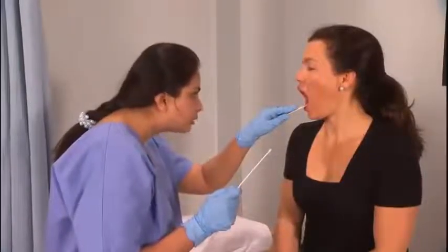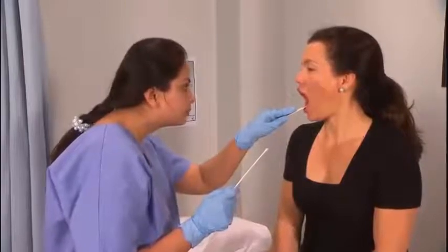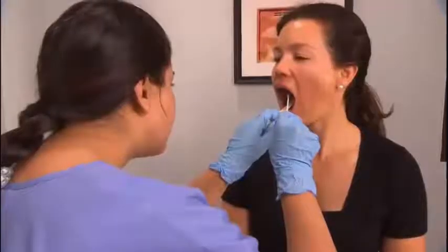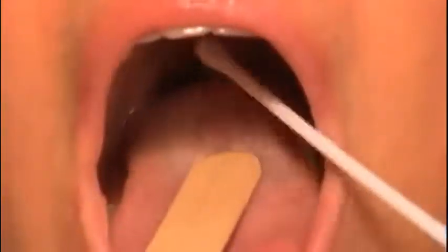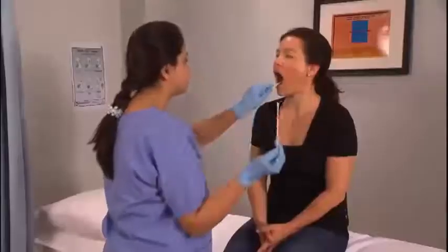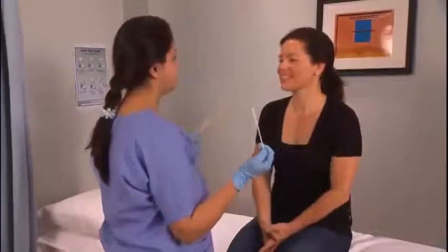Inform the patient that you are about to swab them and insert the swab into the mouth towards the back of the throat. Take care not to touch other structures. Gently swab between the tonsillar pillars and the tonsils. Include any inflamed or purulent areas. Withdraw the swab without touching other structures, then remove the tongue depressor.